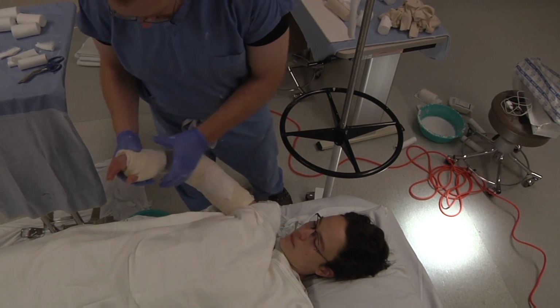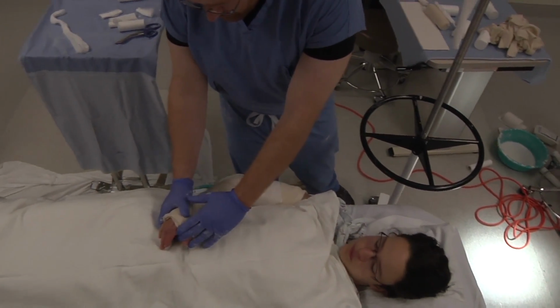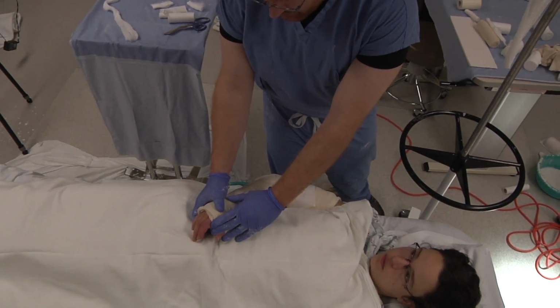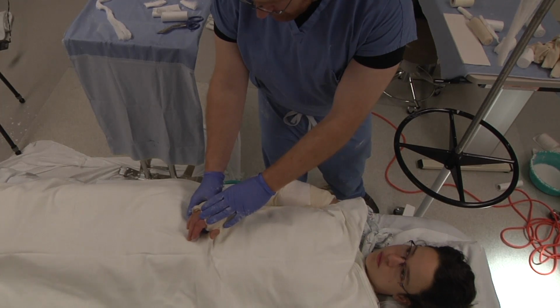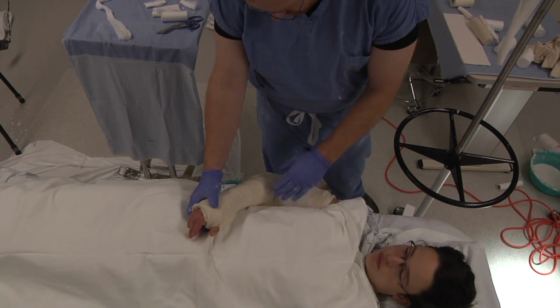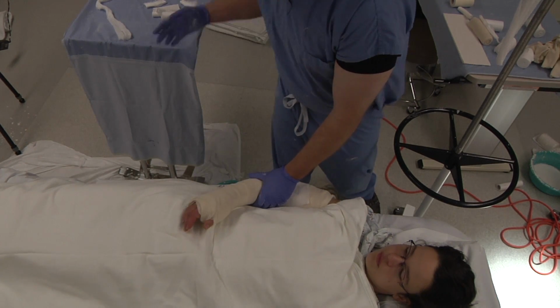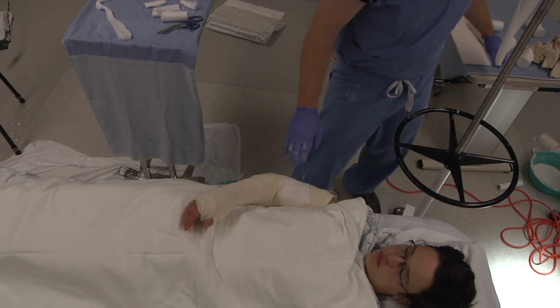release the fingers, either from the finger traps, bring the patient down. Always after splinting is complete, do a thorough neurovascular exam. If there's a negative change in neurovascular status, it may be worthwhile to remove your splint and restart.